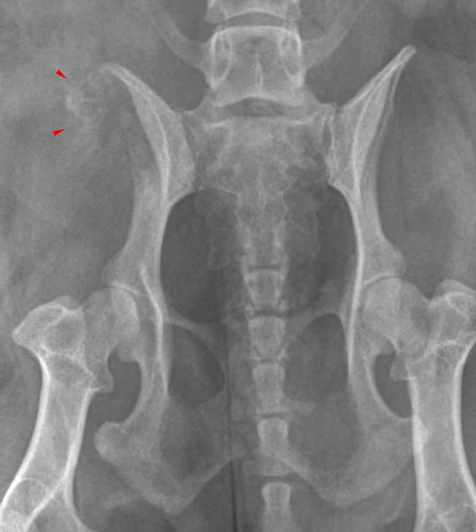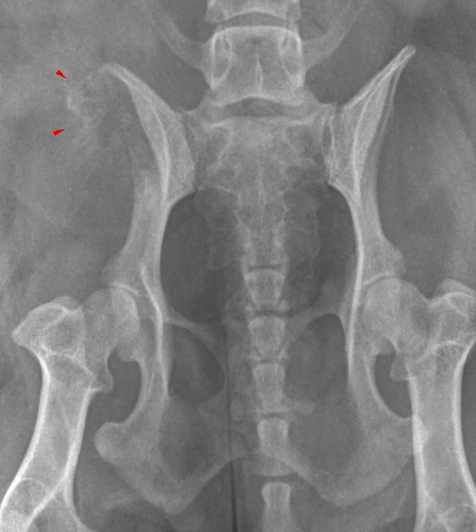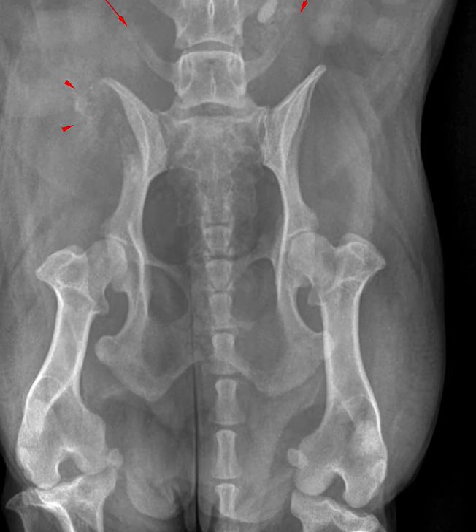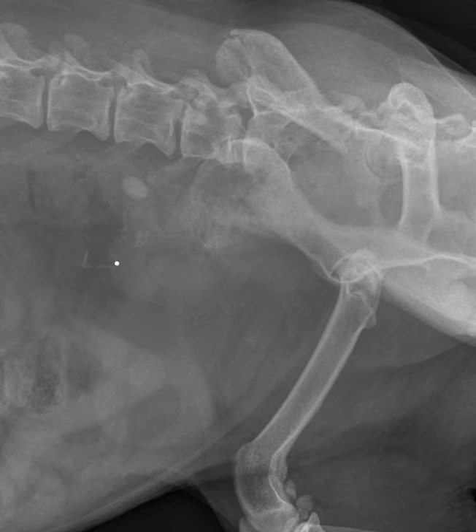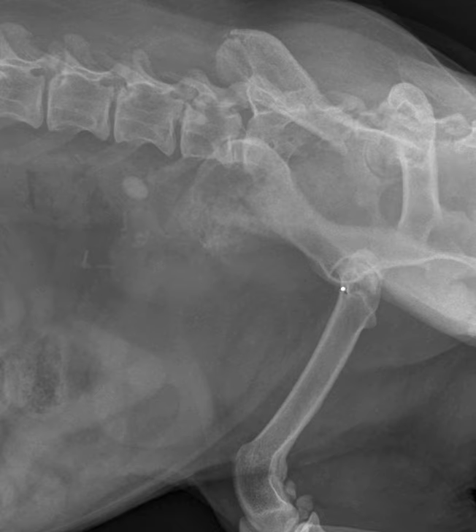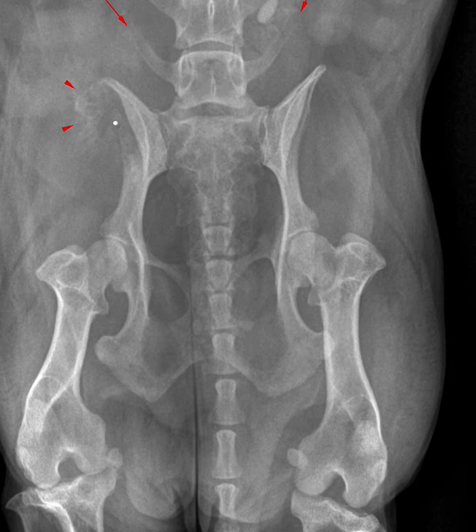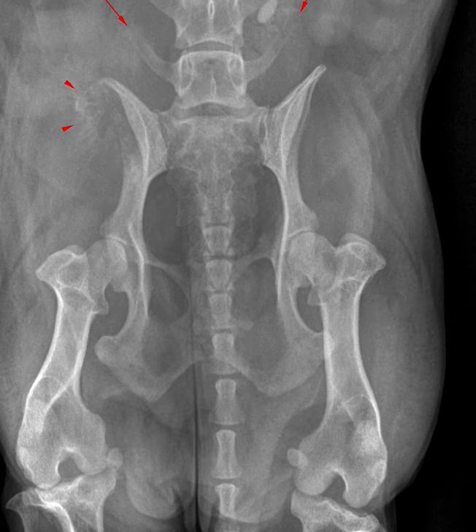In this case, I would prioritize primary bone neoplasia such as osteosarcoma, because it's an older dog with a monostatic aggressive bone lesion. Radiographically, other differentials include a soft tissue mass centered here — there is a little bit of soft tissue mass effect visible on the lateral, which is slightly obliqued — so I wouldn't fully exclude a soft tissue mass invading bone. The other cause of bone lysis would be infectious osteomyelitis, but that is uncommon clinically in dogs, and especially less likely given that this is a geriatric dog.